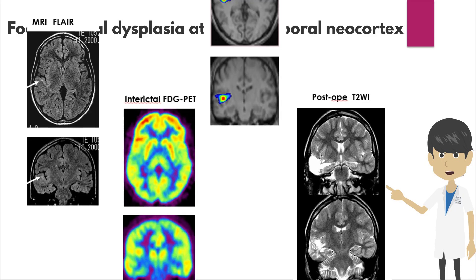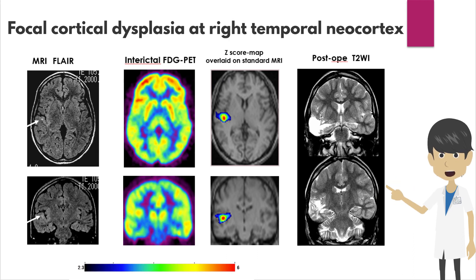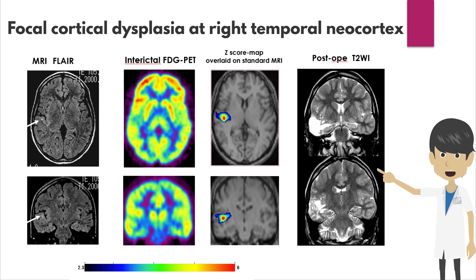Here are the results of the statistical image analysis of the previous quiz case. The statistically dominant hypometabolic area is shown as a color map in the right superior temporal gyrus, and a slight high signal is seen in the hypometabolic area on the MRI FLAIR image. Focal resection was performed and post-operative pathology confirmed focal cortical dysplasia.